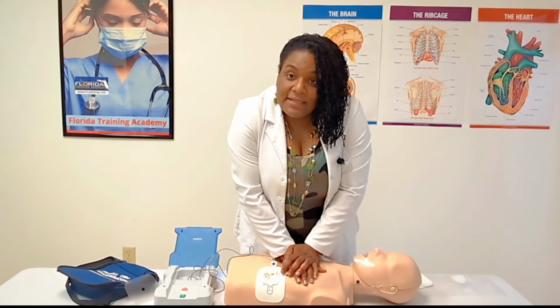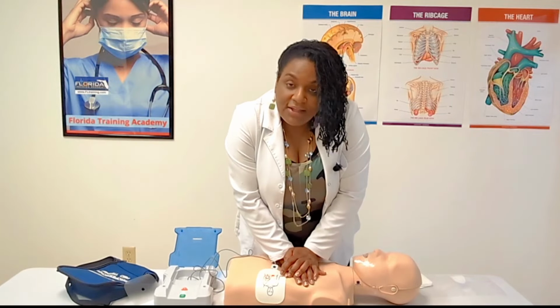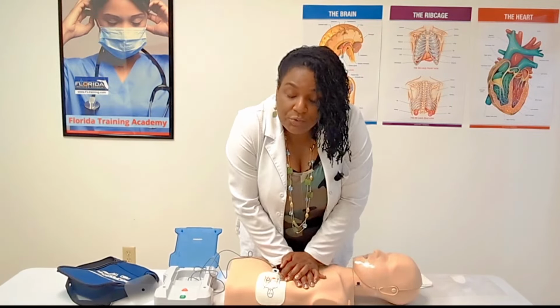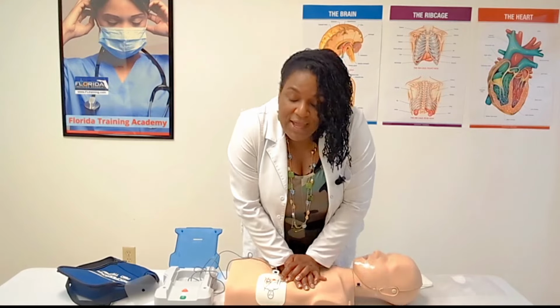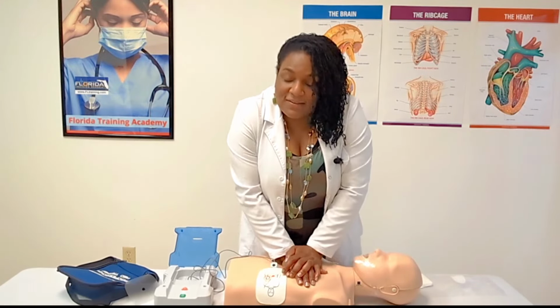So all of your AEDs that correspond to current guidelines should have that tone, which is referred to as a metronome. And you want to keep the pace.